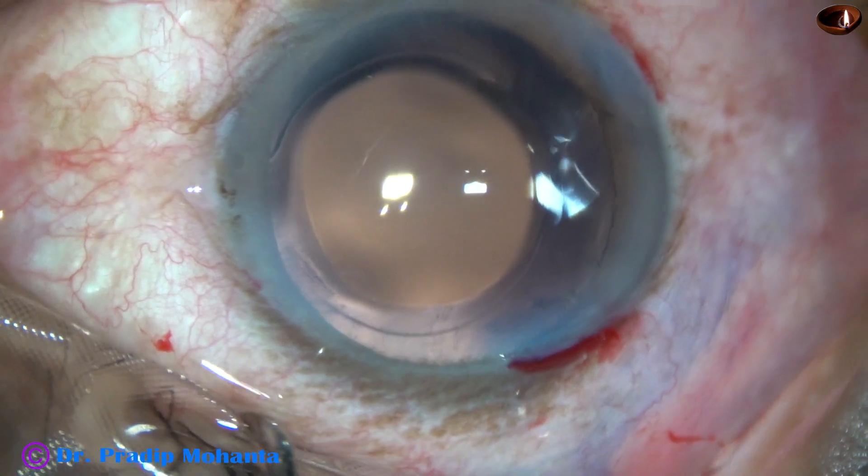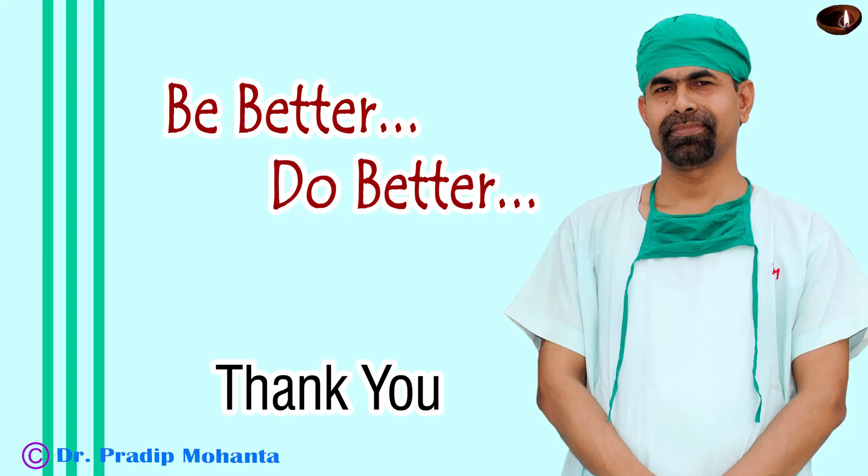A few drops of moxifloxacin are applied over the cornea and the case is concluded. Thank you very much for your attention. Hope this video will help you in developing your surgical skills. Please do not be afraid of an intumescent cataract after watching this video. If you do not have sodium hyaluronate, or if you are practicing in an area where the socioeconomic condition of your patients is not good, you can very well manage with HPMC, a very economical visco in India. Be a great surgeon and serve your patients with love, respect, empathy, and great surgical competence. Thank you very much.